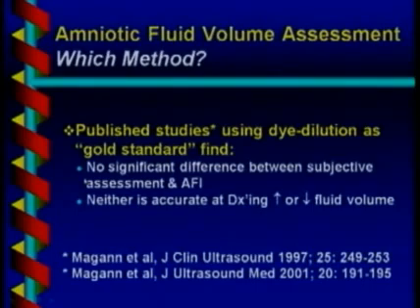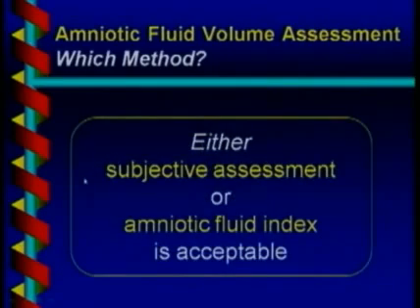So either of them is about as good as the other. But unfortunately, neither of them is terribly accurate at diagnosing elevated or decreased fluid volume. So they're not great, but they're all we have. So you should always assess fluid, and you can use either subjective assessment or amniotic fluid index. Either one of them is acceptable.